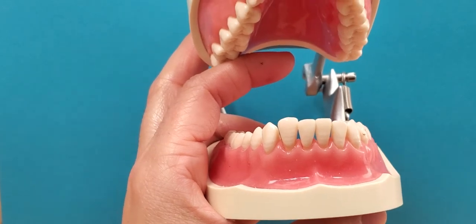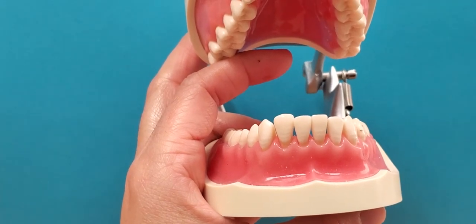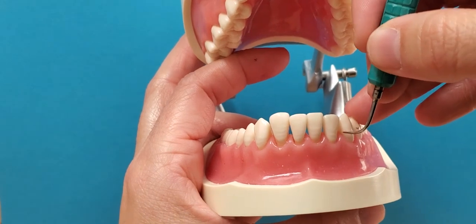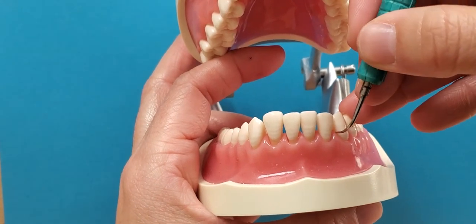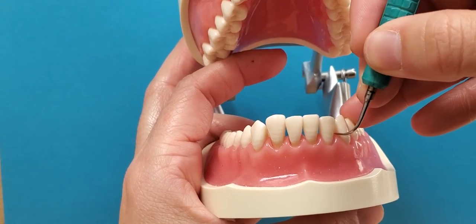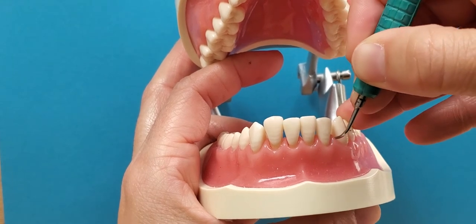You can also use curette style instrumentation with ultrasonic scalers. For curette style, you're going to position the instrument like you would a curette, and this can only be used for interproximals.